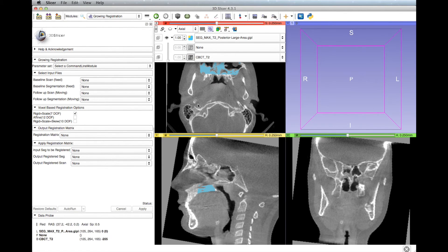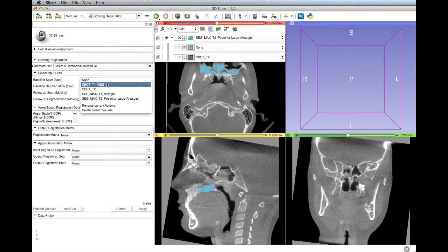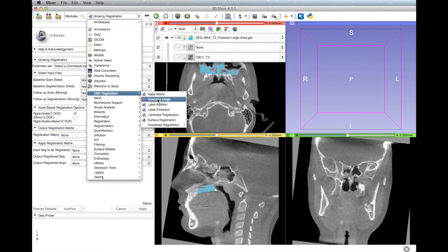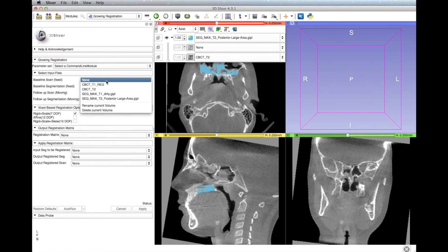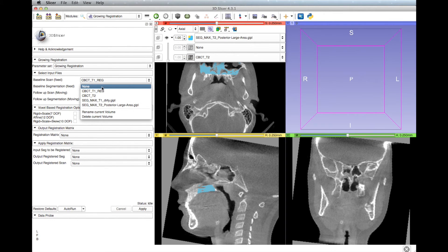To start the voxel-based registration, go to Modules, then CMF Registration, then Voxel Based Registration, and finally Growing Registration or Non-Growing Registration depending on the age of the patient. Under Select Input Files on the left toolbar, for Baseline Scan Fixed, select the T1 scan. For Baseline Segmentation Fixed, select the T1 mandible segmentation.